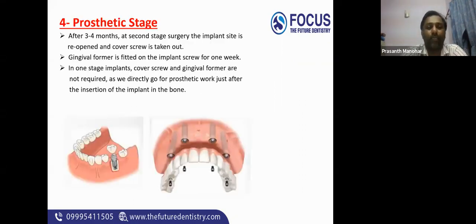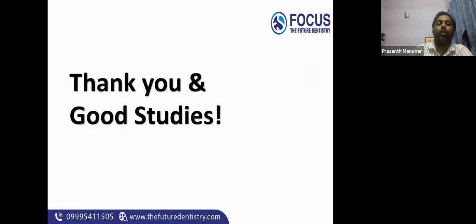Coming to the prosthetic stage, it is done after the osseointegration, that is 3 to 4 months after the implant placement. We will again reopen the flap and remove the cover screw. The cover screw is that component which covers the implant. Gingival former is placed for 1 week. Now gingival healing will take place. After that, the gingival former will be removed, and abutment will be placed, and over the abutment we will give the prosthesis. So this is the basic idea regarding the implant prosthesis.